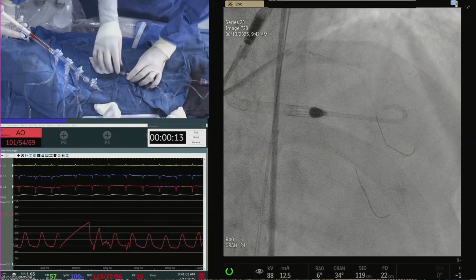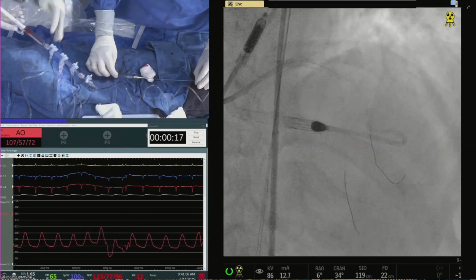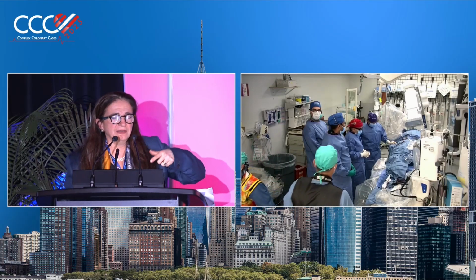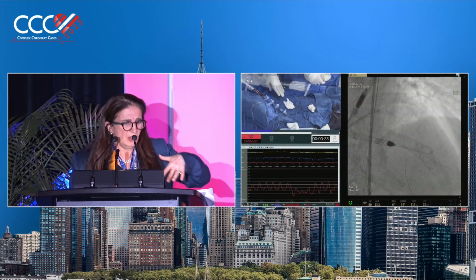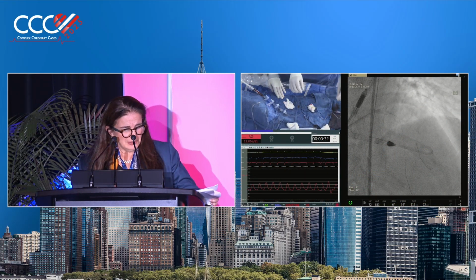Okay, done. We're going to room 3. We'll dilate and show you. But just tell me, what are you going to do in that diagram? In the LAD, you're just going to try to dilate? No, we'll put a stent. Our goal was bifurcation stenting, doc, but we will see what we can do.